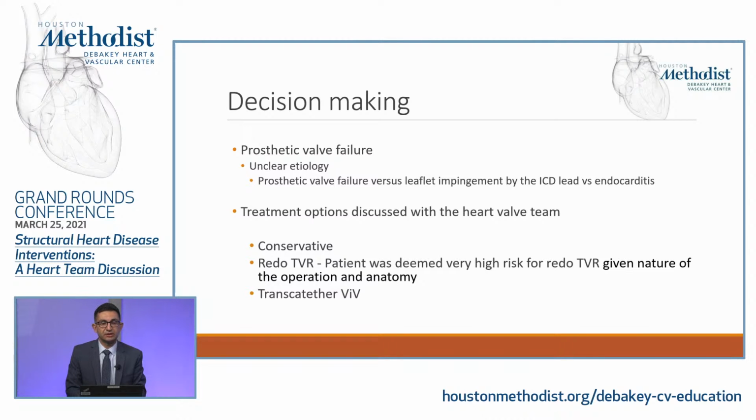We discussed her presentation with our colleagues in electrophysiology. They felt that the patient still needs the defibrillator, despite the LV function being improved to the mild to moderate category, because of the arrhythmic events that she had in the past. So the plan was to proceed with a valve-in-valve option.